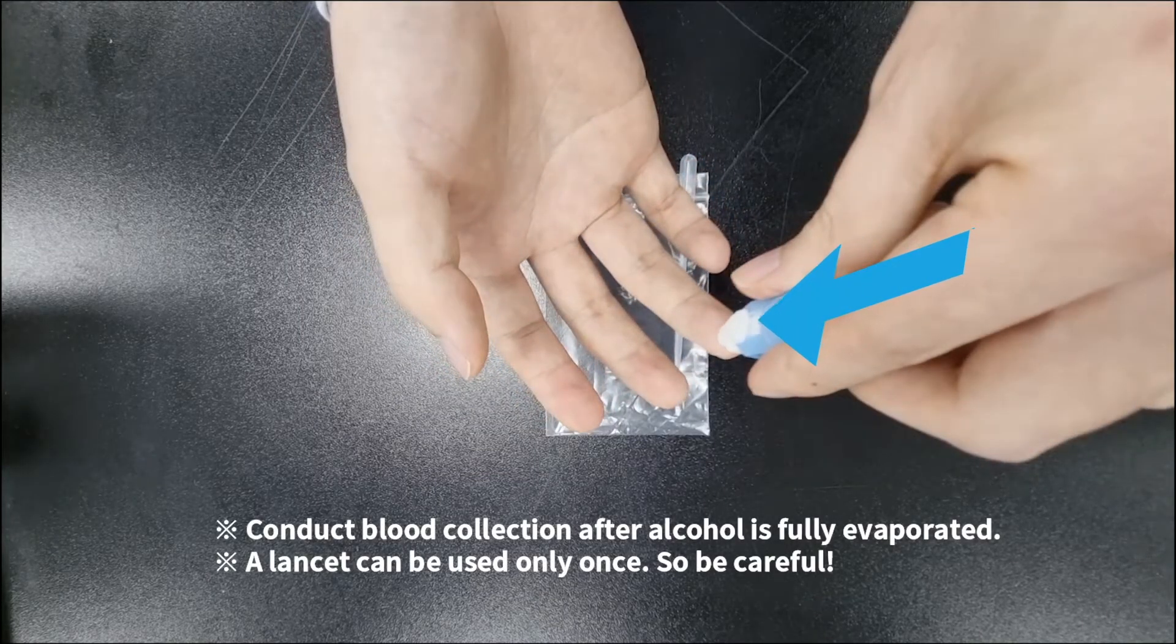Press the lancet firmly against the swab clean skin area to activate the lancet.